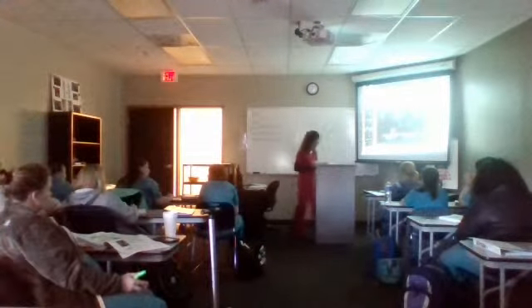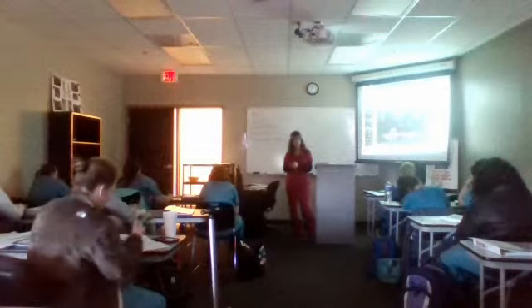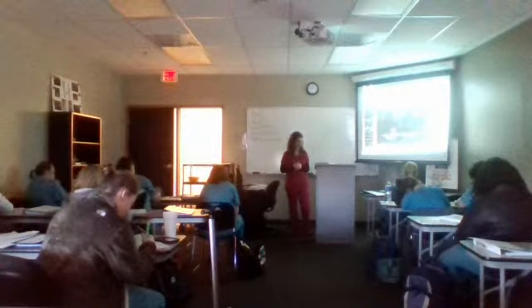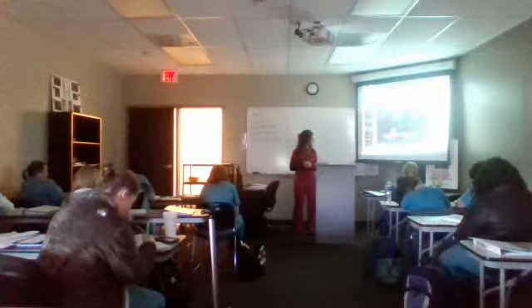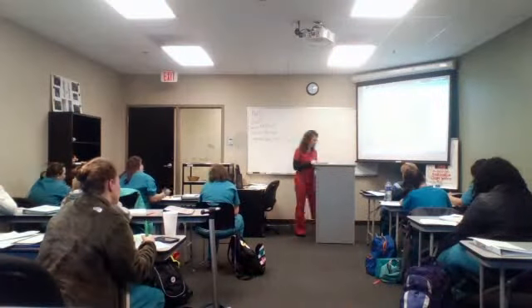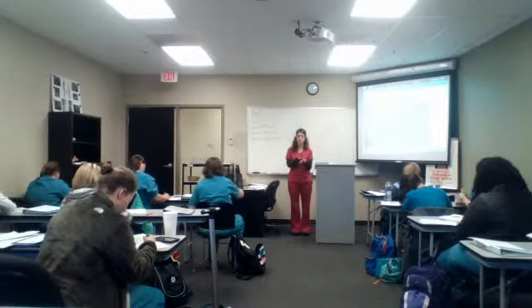Alright? The second one is called the Valsalva maneuver. V-A-L-S-A-L-V-A. Valsalva maneuver. And they don't have a Valsalva maneuver on here. This is what's in your book. Alright, Valsalva maneuver, it makes sure that the proximal valve closes.